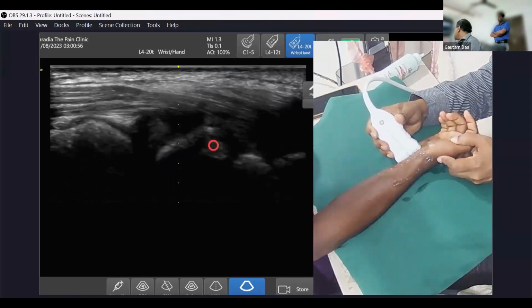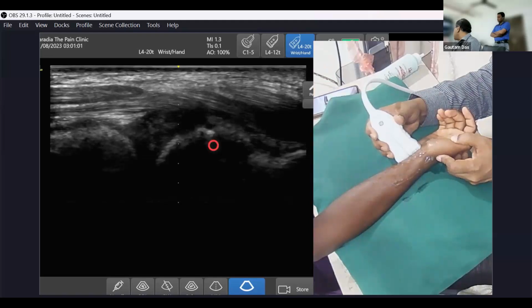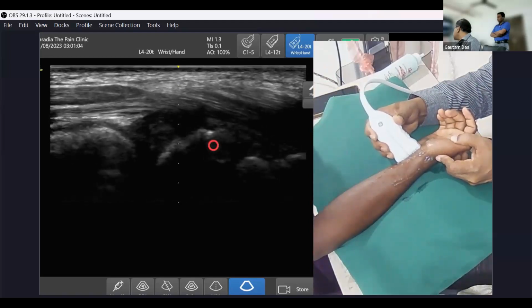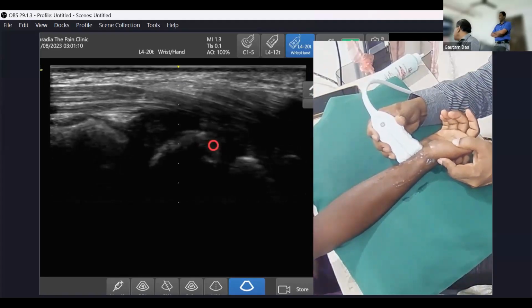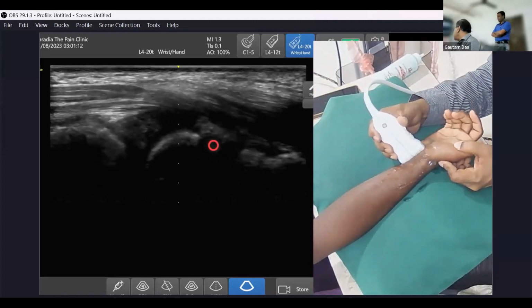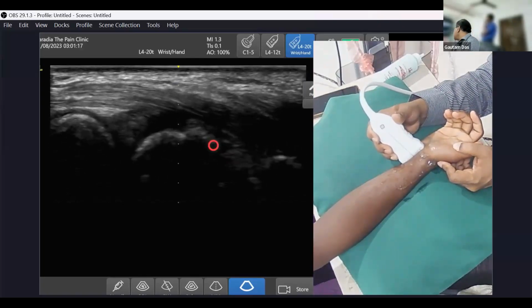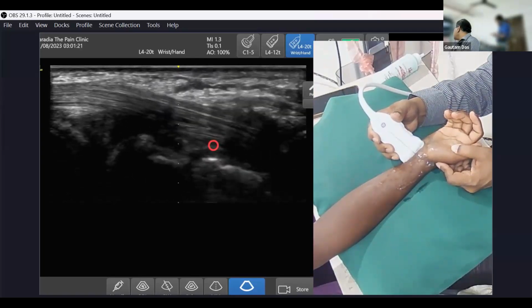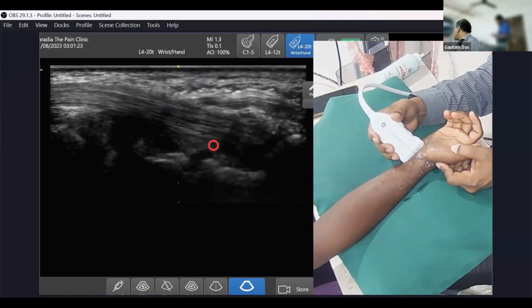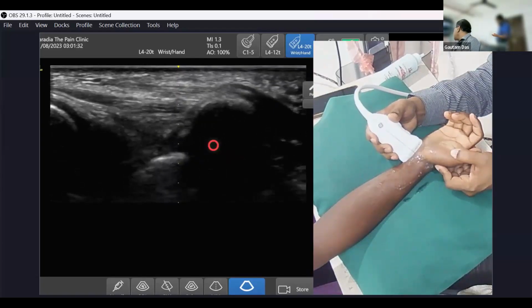One part of the bone is your ulna. Not the whole ligament is seen; a little bit of the area is hypoechoic. As I told you, the ligaments are sagging down, so the whole part might not be seen. Now at this position, I'm fixing the ulnar side and rotating the distal part over the capitate. So now this ligament is your ulnocapitate, with the ulna on one side and the capitate on the other. And if I rotate the probe further, this is the ulnotriquetral ligament.